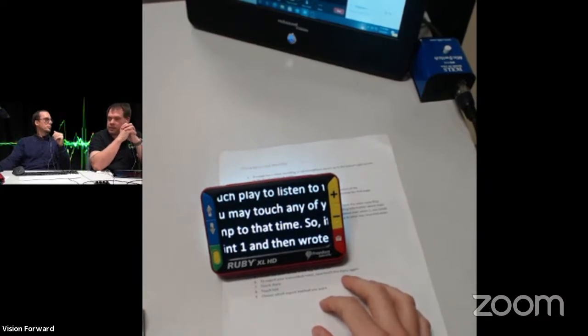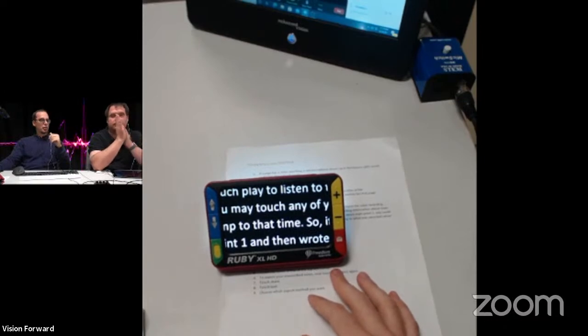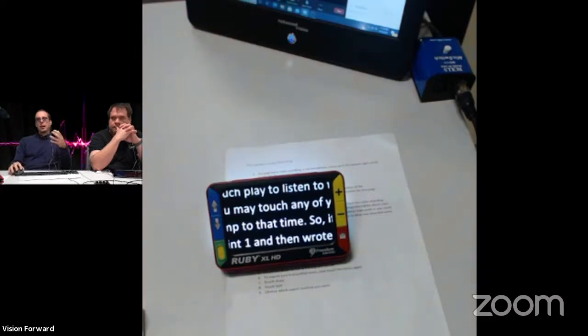When we look at this device, it's great and does a good job, but there's a cost factor. There's being able to use it. There's keeping it safe. And you're right. Sometimes the best solution is the simplest solution, and like you said, that could just be printing out large print. It could be getting large print books. That could be even just a regular magnifying glass, a dome magnifier, sufficient lighting. So there are other things to consider. But at some point, and you'll know, depending on the student and how well they're doing with the lower tech side of things, if it's not working, then you can consider going to a more high tech device.